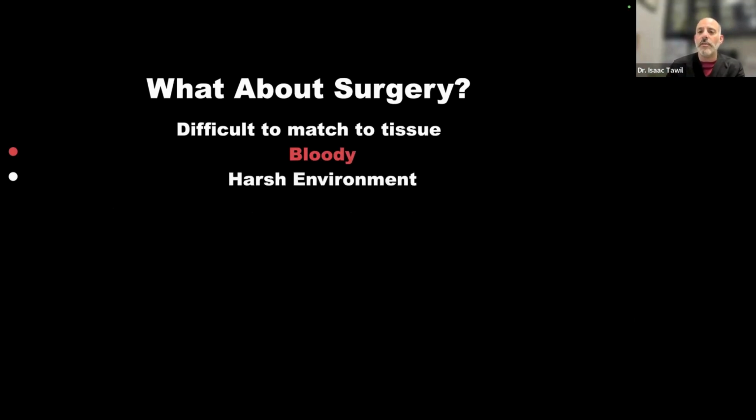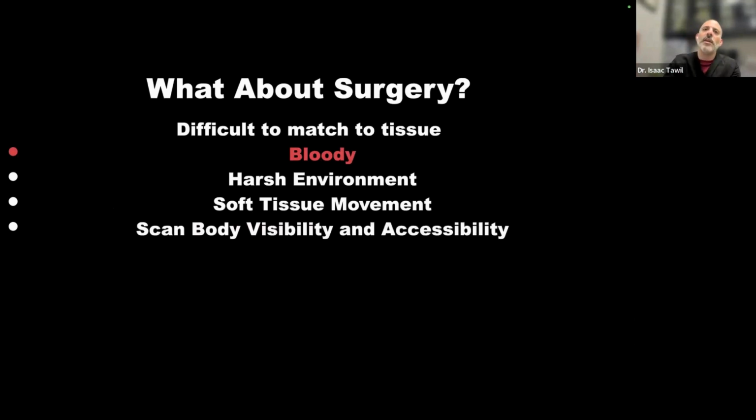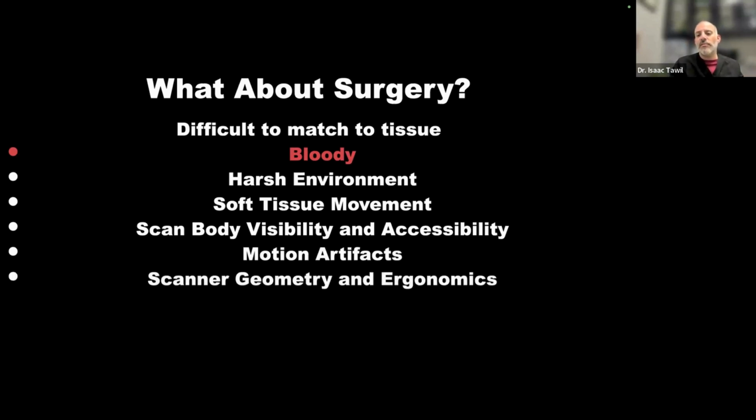We have a very harsh environment with the tongue. The patient may be sedated. It's kind of like going to war when you're in surgery and you're pulling the cheek and stretching and pulling all that tissue around. So it's very hard sometimes to even get access because we may have a bite block in the mouth to try to capture. All of these things make it harder, including the motion artifacts and, of course, the scanner itself, the time and pressure from surgery, all of these things.